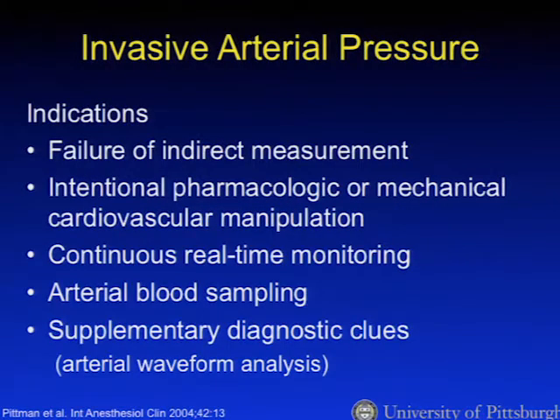That brings us to invasive pressure monitoring, which is indicated really anytime the non-invasive techniques fail or when continuous real-time monitoring is desirable, either because of patient or procedure factors. The presence of an indwelling arterial cannula also affords the advantage of serial blood sampling for laboratory analysis and can provide a wealth of supplementary information.